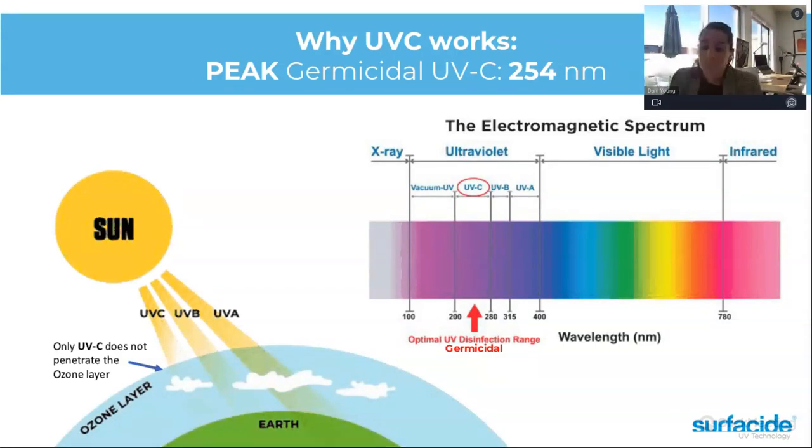I see you have UV placed in the ductwork, is that the same? If it is placed in your HVAC, I will say it is essentially the same. However, we work with many HVAC companies who have said that the HVAC working a little as an air purifier should not be considered as keeping your air at the level you want for a dental practice or a healthcare facility.